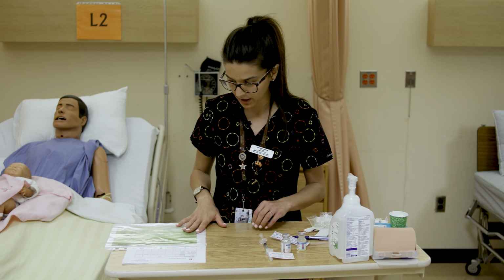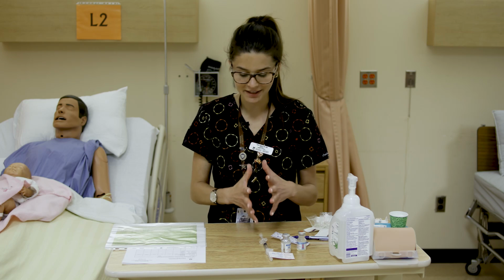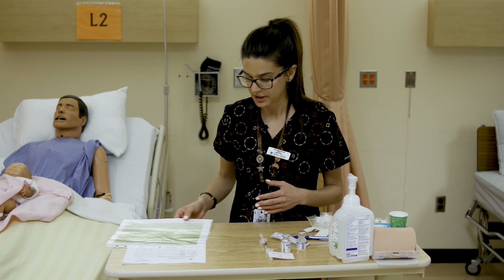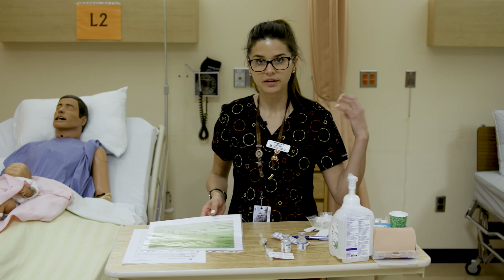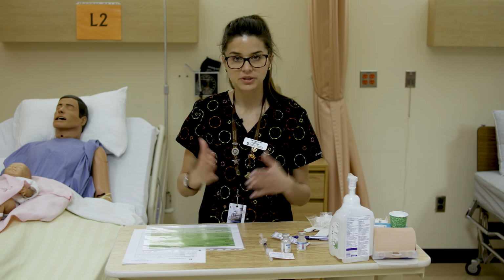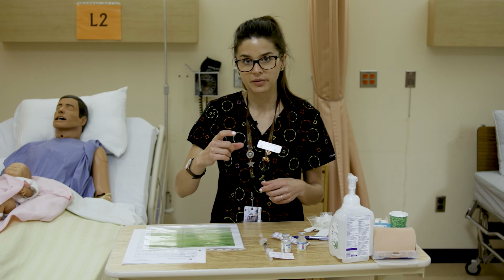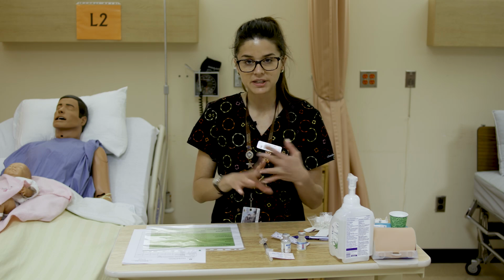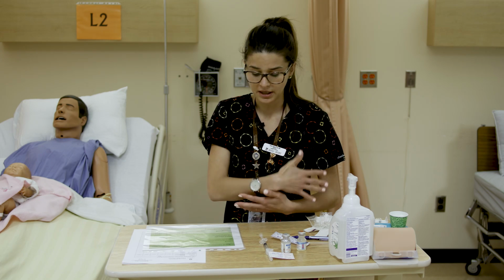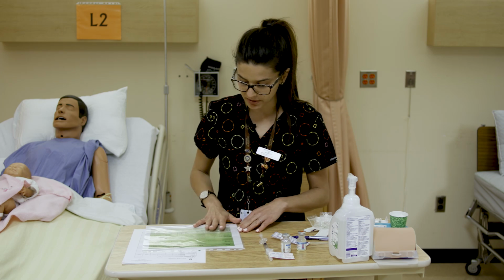So there are parameters. Different facilities vary just slightly on their parameters, but most are fairly similar. So depending on the muscle that you select or the muscle group that you select, you can do different lengths. Also depending on the size of the patient, how old they are, would dictate their size, but also maybe how much subcutaneous tissue they have between their skin and their muscles. So you have to go a little bit deeper on certain people.